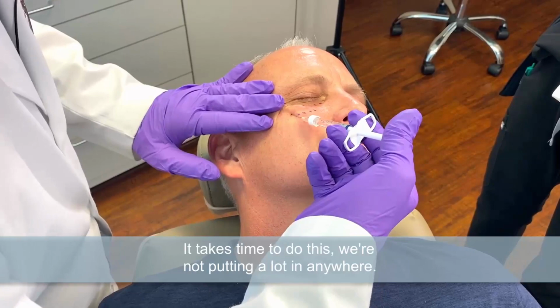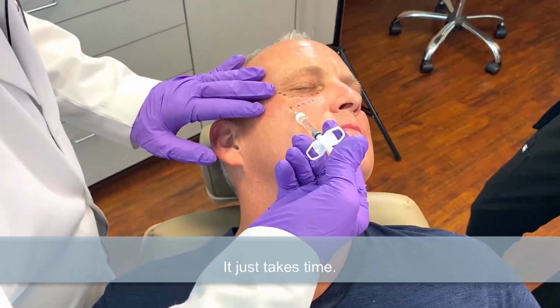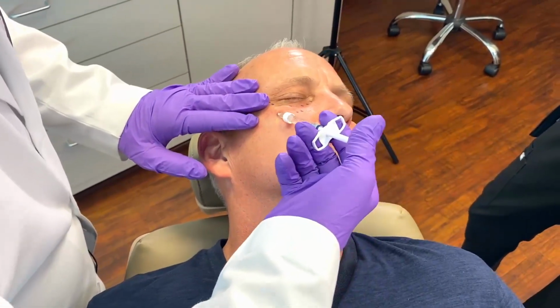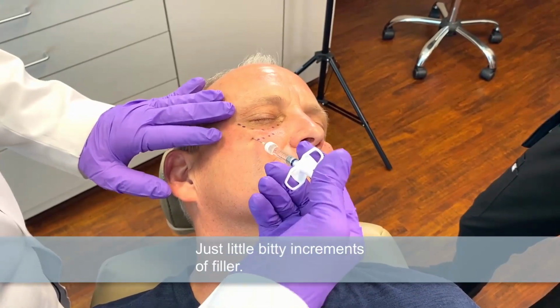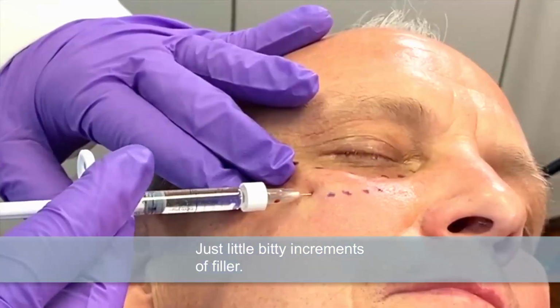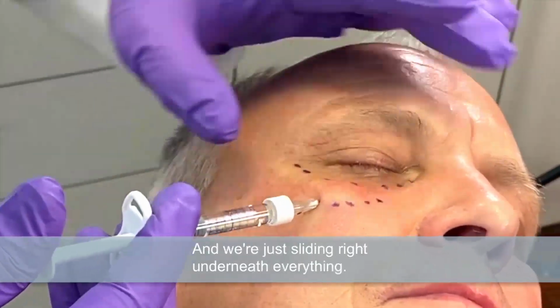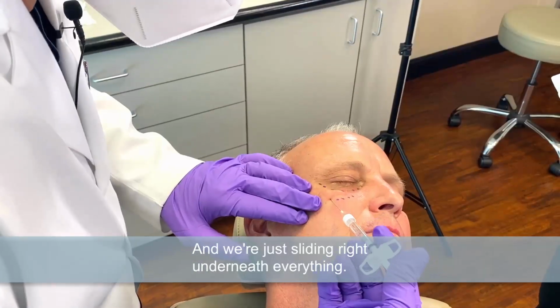It takes time to do this. We're not putting a lot in anywhere. It just takes time. Just little bitty increments of filler. Going back over here for the last little bit. Again, we're just sliding right underneath everything. And the last little bit here.